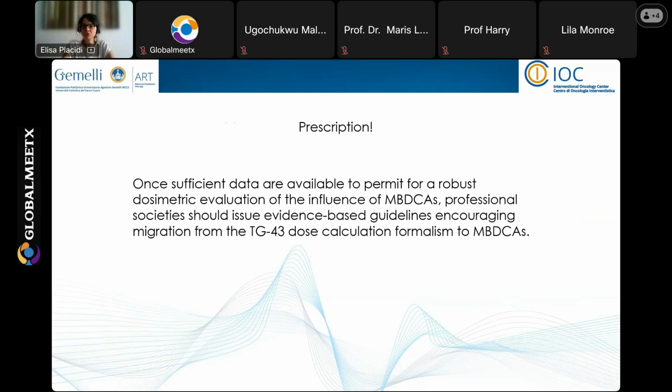So when we move to a better algorithm, it's not so straightforward. We don't just say, okay, we now calculate with the new one. We cannot ignore the consequences because, as I said, if we assign properly the mass densities and so on, then the results could be very different. So we cannot just change algorithm and treat, because we have to evaluate those differences.